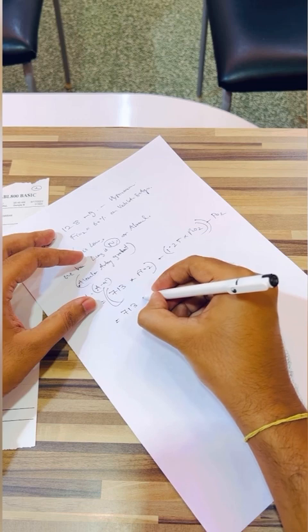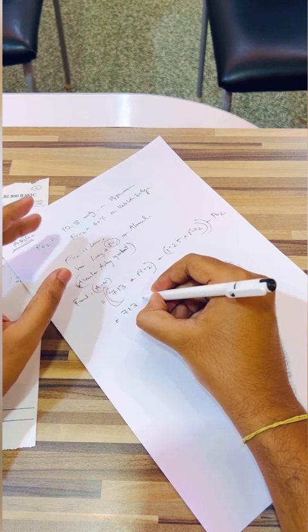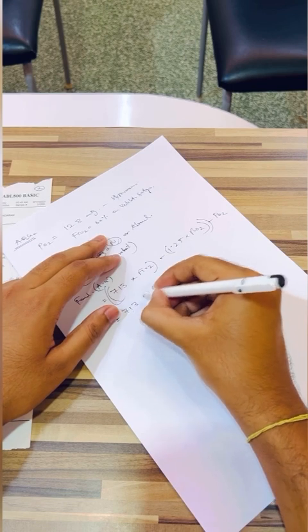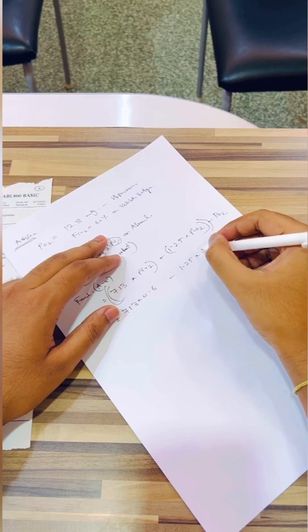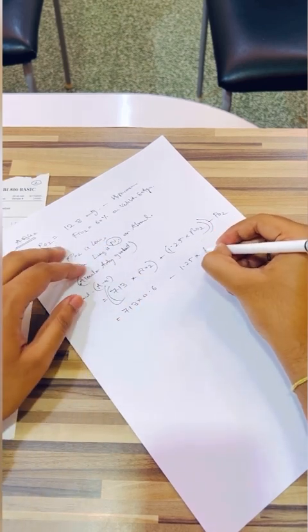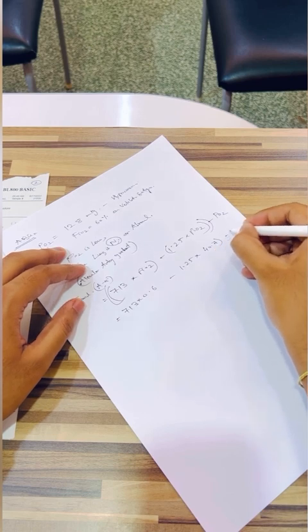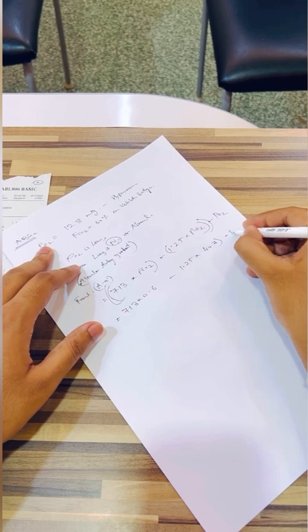So 713. In this case, the FiO2 is 60, it's 0.6, and 1.25 into the PCO2. The PCO2 of this patient is 40.7, and minus the PO2. The PO2 of the patient is 128.